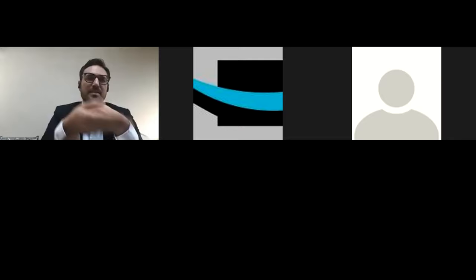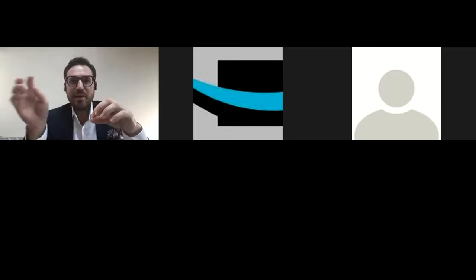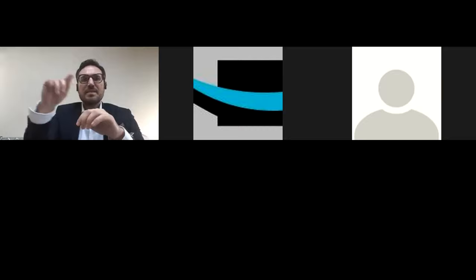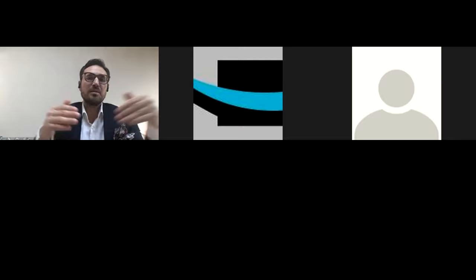So I need a template with a white opaque resin, not as the surgical template, a special template, okay? A white, opaque template, with holes and other areas in which you can see the geometry of your scan abutments. You can also have the surface of the teeth in order to facilitate the technician to match, to align perfectly your scanning of the arch to the project, the initial project, the same project of the mock-up, and you can perform perfectly your protocol, your workflow.